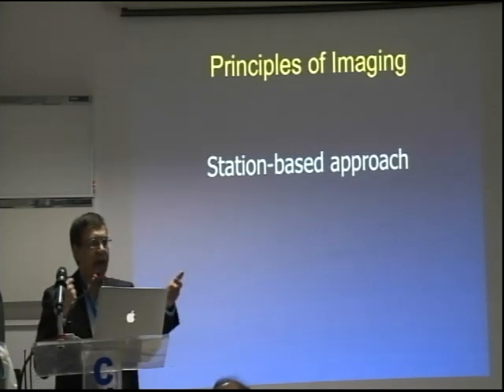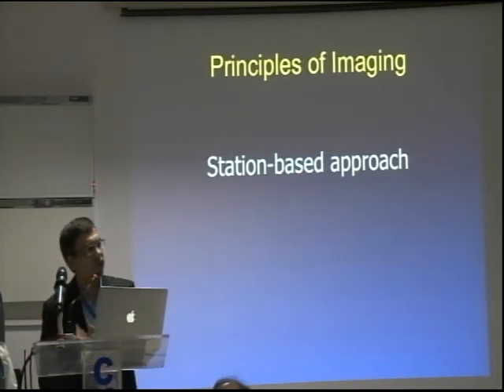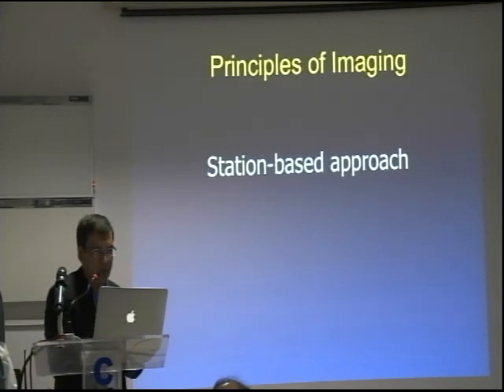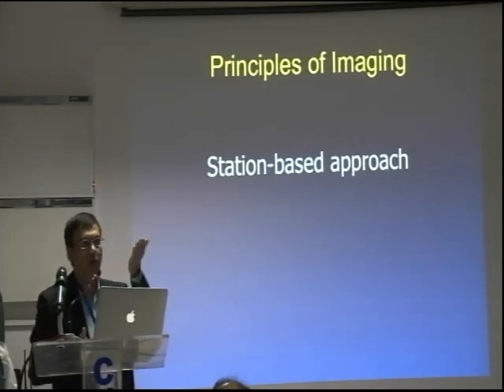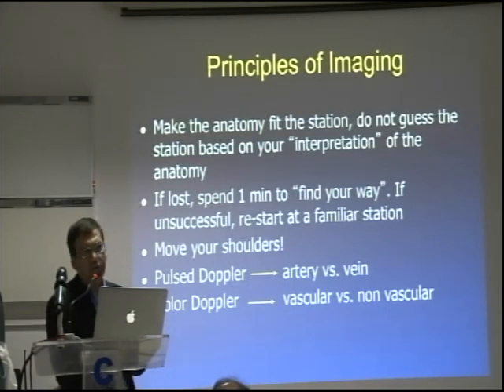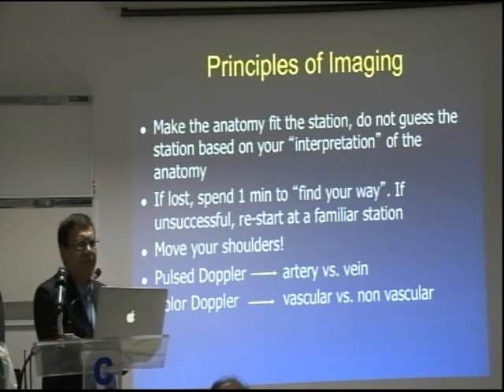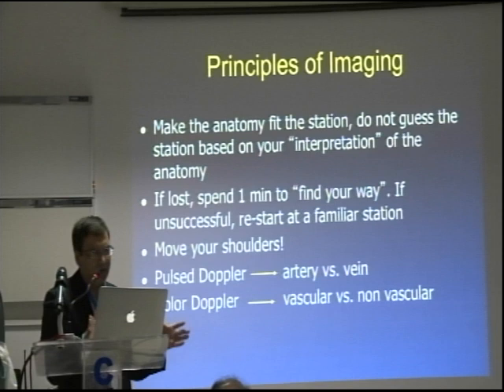So you should have your own stations. We'll go through the book stations right now, but you can have your own stations, and I'll demonstrate how my stations work for me, how I start, where I go. I go from the top downwards, and then on the way back, I do everything in one pull, all the stations. So when you're doing EUS, trust me, you're going to be lost for many years. So you will be lost.